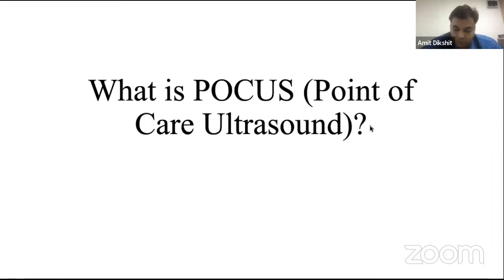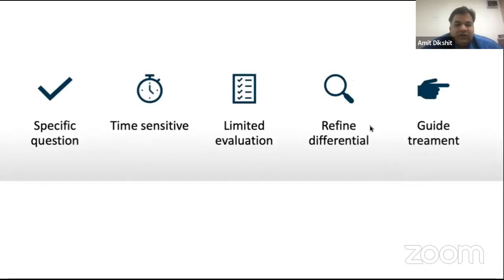So what is point of care approach? And this is one everyone must understand. We are not assessing like a radiologist. Just go and assess airway, no, nothing like that. We have a very specific question, and that is called focus approach. Whenever the answer is binary in form of yes or no, is this patient a case of pneumothorax? Yes or no? Is it endobronchial intubation? Yes or no? Is this size of tube enough for this patient? Yes or no? Is intubation difficult? Yes or no? So all these, what is the tongue thickness? So all these are yes, no questions.